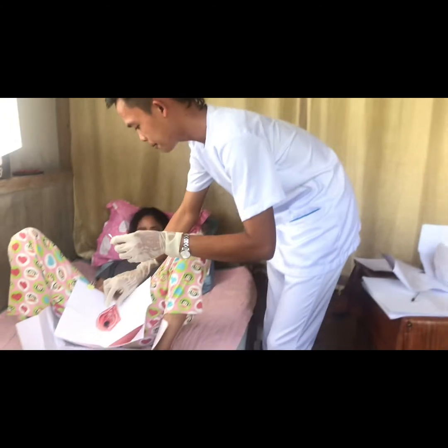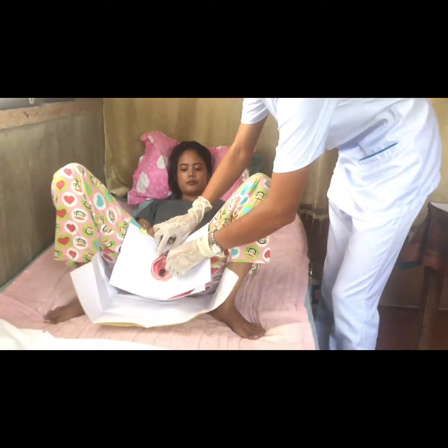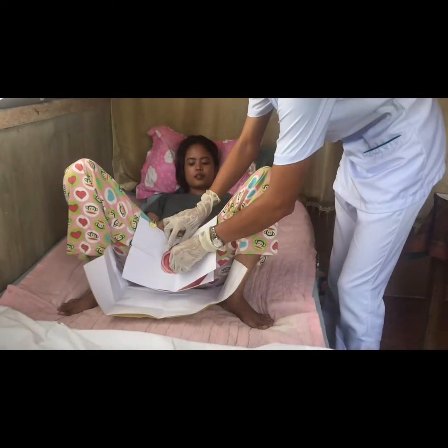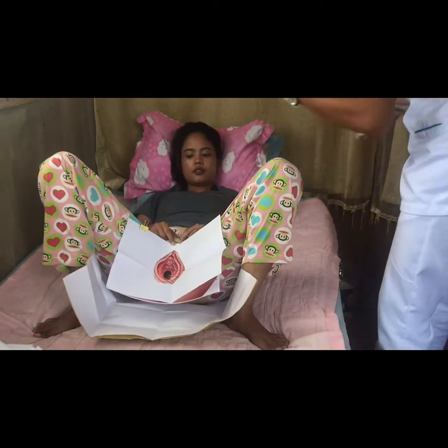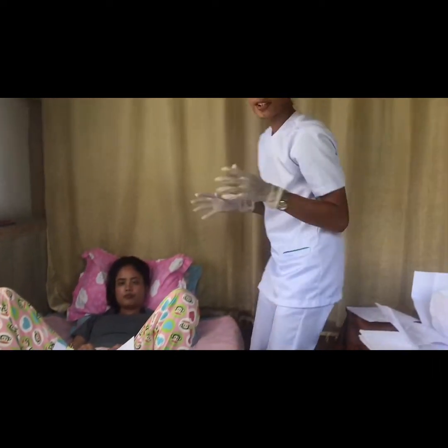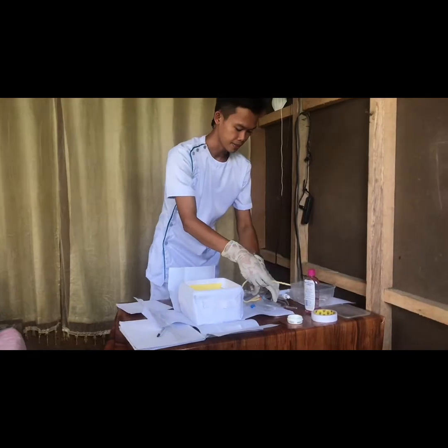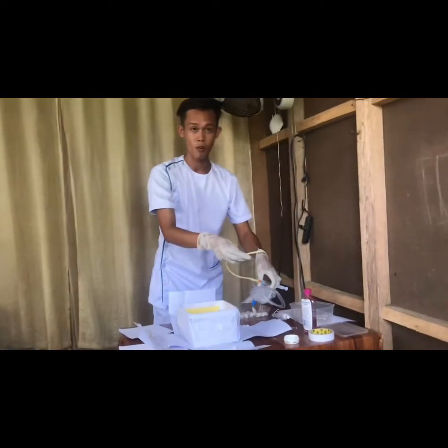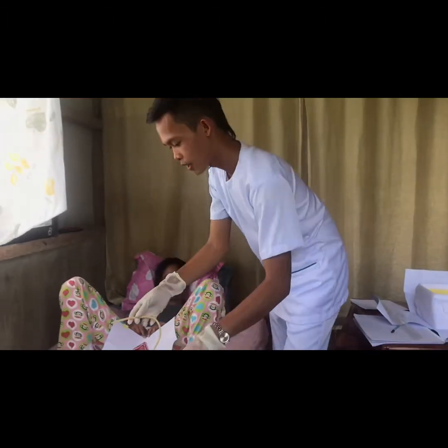Are you okay, ma'am? Yes. Okay. Do you feel nervous? No. Okay. So this alcohol swab, I'm going to dispose of it. So this time, I'm going to set aside all of the equipment that we're going to use for the catheterization.